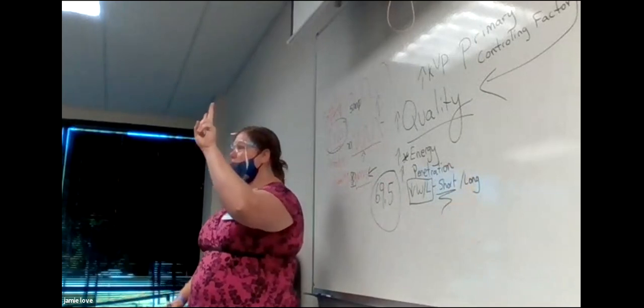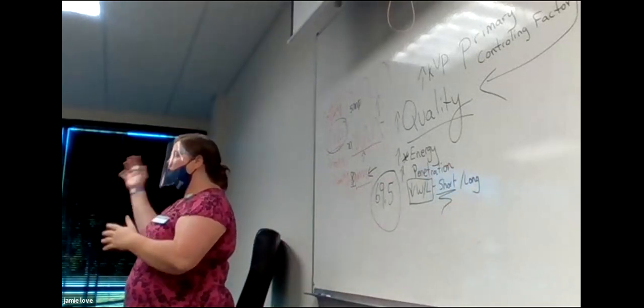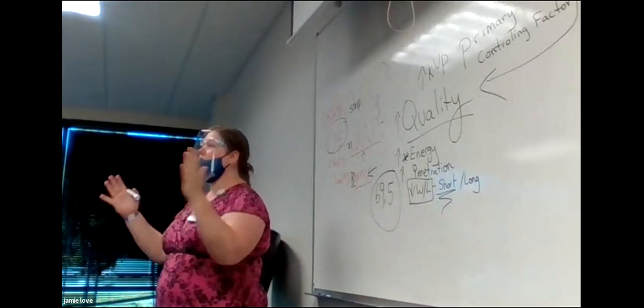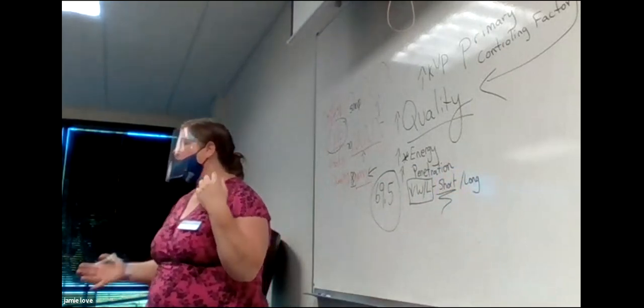There are two things that we talk about when we're talking about our beam. Our quantity of our beam, how many are in it, and our quality, what's their energy level? How penetrating is it?